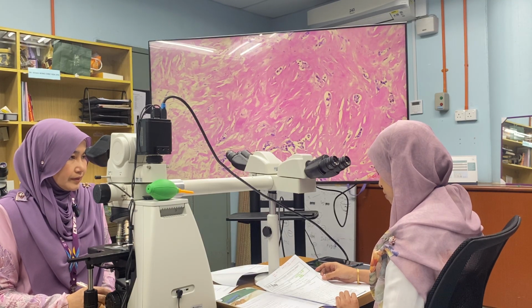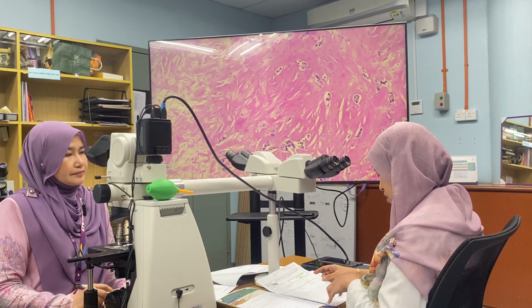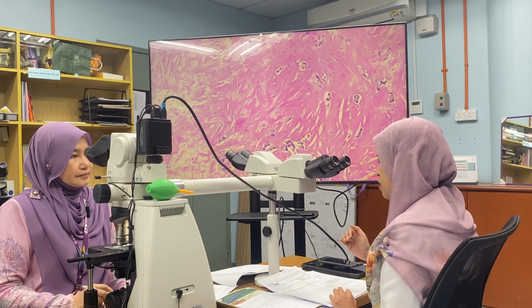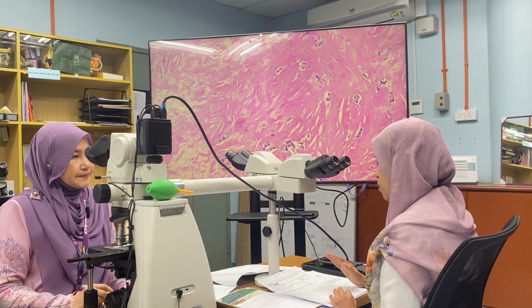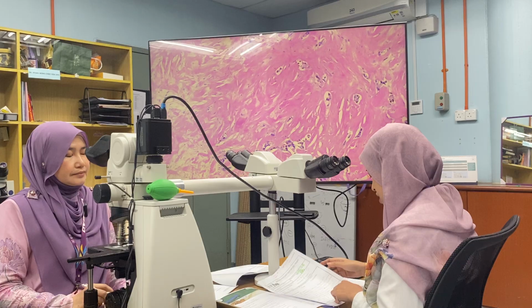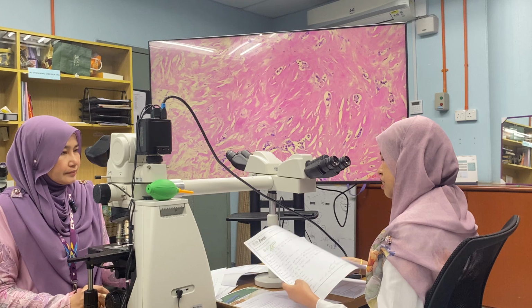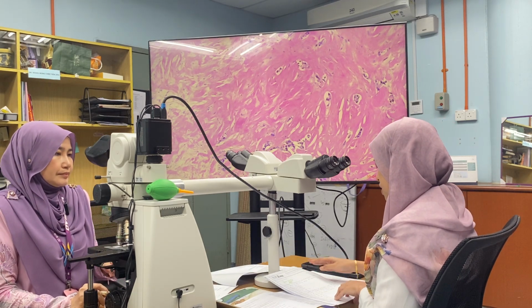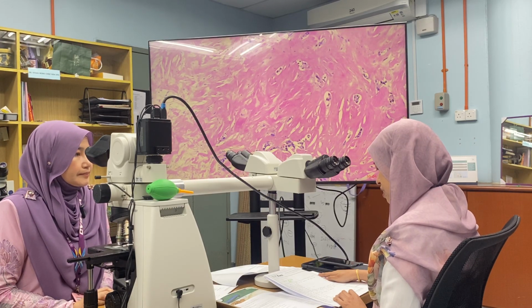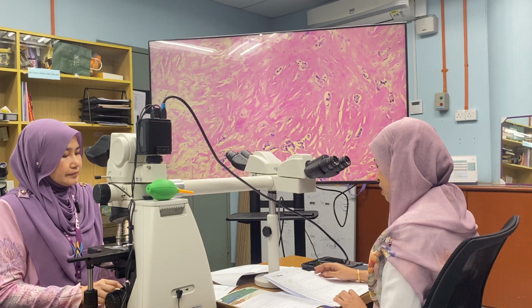The deep margin of the tissue is composed of fatty tissue with one focus of muscle. Upon palpation, there is a firm to hard mass on the upper outer quadrant, which correlates with the radiological imaging of the previous tumor size. On cut section, there is a whitish lesion measuring 40 x 30 x 15 mm. The distance of the lesion to the margin is as follows: 75 to superior, 20 to inferior, medial 25, lateral 110, less than 1 mm to the superficial, and deep 14 mm.